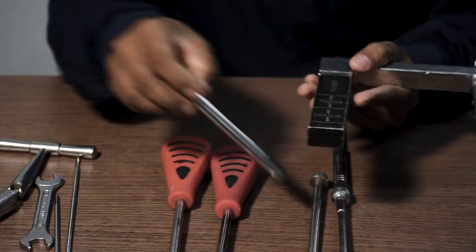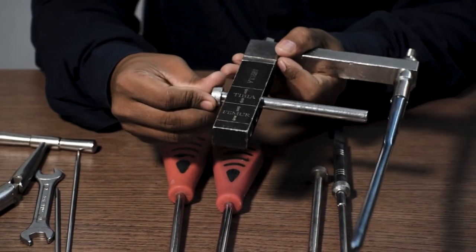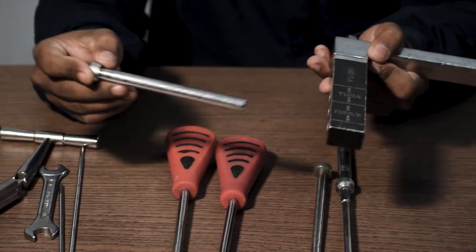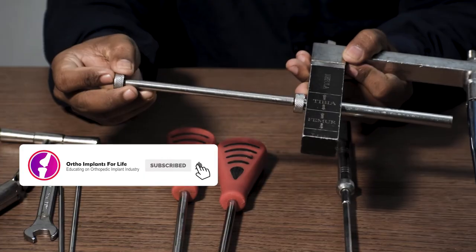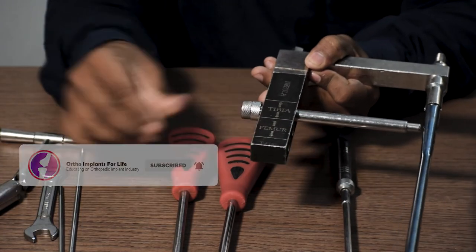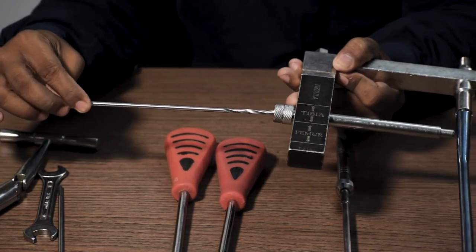Like when you tested, we will apply the same procedure. First 4 mm protection sleeve is inserted, then through it 4 mm drill sleeve is inserted, then the drilling is done with the 4 mm drill bit.